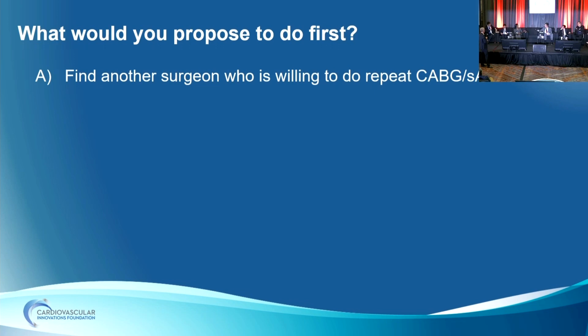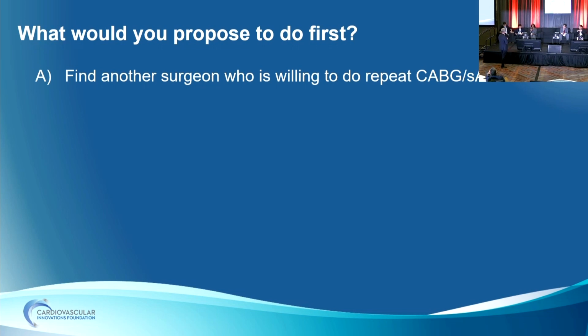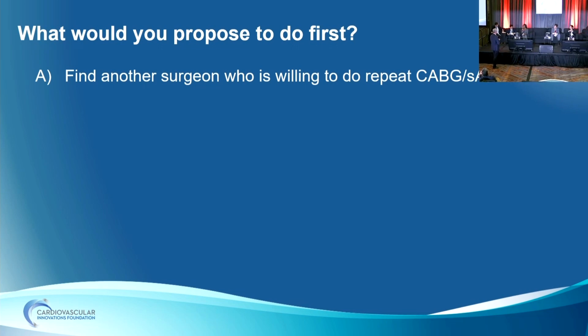Kit, what would you do in terms of either TAVR or PCI and support or not? Yeah, I plan to treat that left main bifurcation. Support's going to be an issue because of that severe aortic stenosis. Crossing the valve will be tricky. But yeah, I'd go with PCI first.